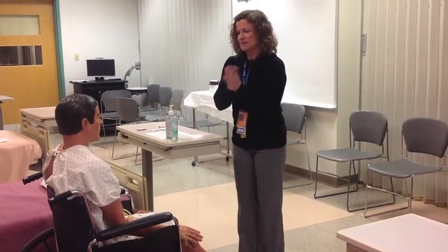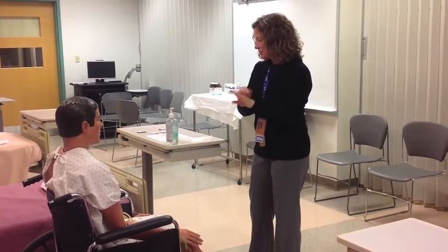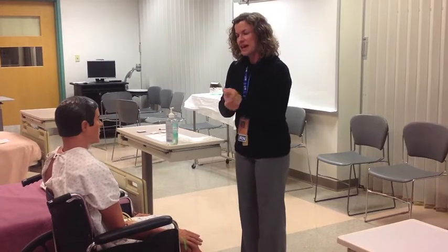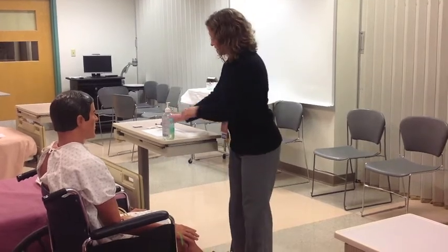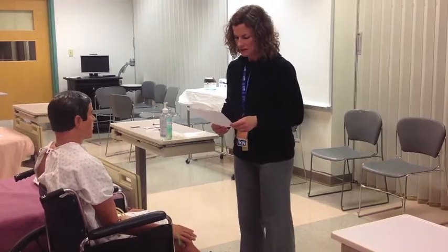Hello, Mr. Fluids. My name is Karen. I'm going to be your nurse today. Your doctor has ordered a dose of Lasix for you. It's to help you with the swelling in your ankles, and it's also going to help bring down your blood pressure. But first, I need to check your name and verify it with the medication administration record.